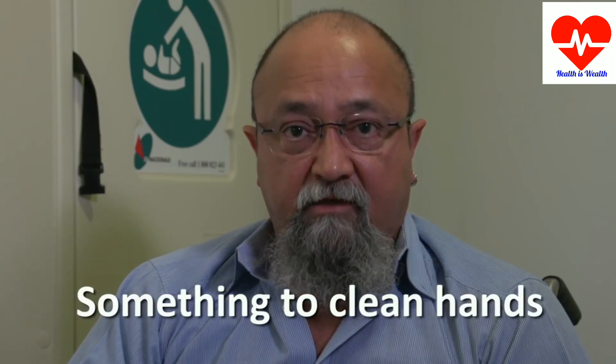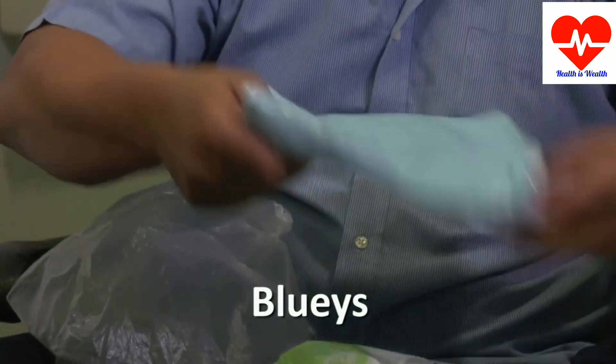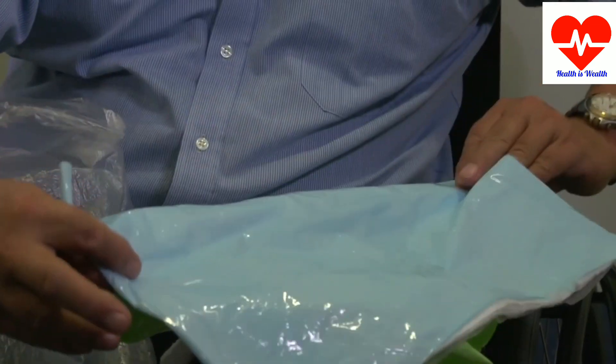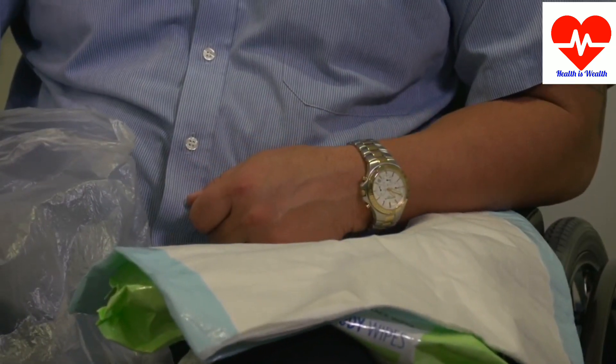Something to clean your hands with. If you're in the loo you can use soap and water, but it's handy to carry wipes, antibacterial gel, or debug gel. Blueys help keep all your equipment together and are a clean surface to place the equipment on, but if you don't have them you just need to set up a surface to use.